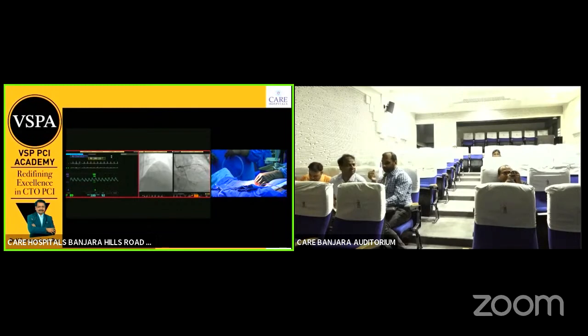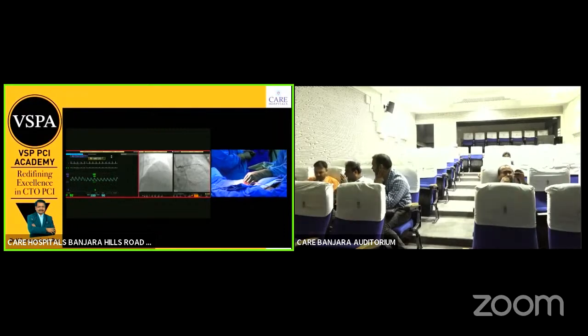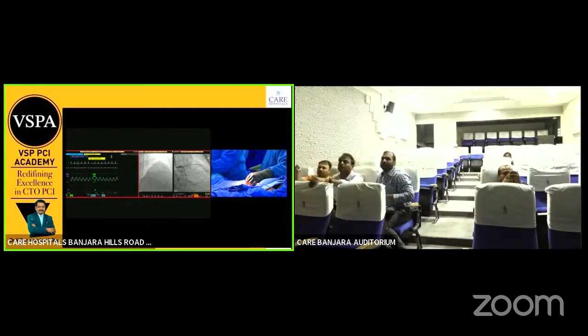Take the 2.5 balloon. That you can go. Nageshwar Rao patient you can shift.